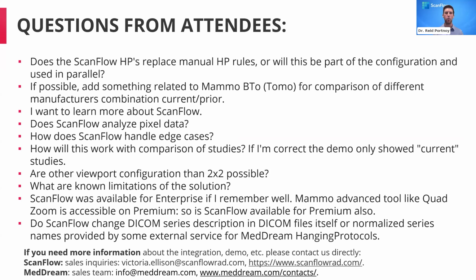Once we recognize this limitation that is institution specific, we can figure out a way so that when a radiologist pulls up an outside study from a different institution, the hanging protocol becomes consistent for that radiologist from that outside institution. I know that sounds complicated, but at the end of the day, we're very fluid. We recognize this limitation, and when it happens, we're going to make it more consistent for radiologists.